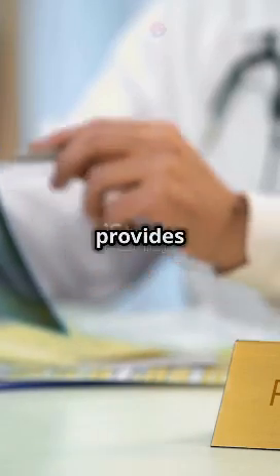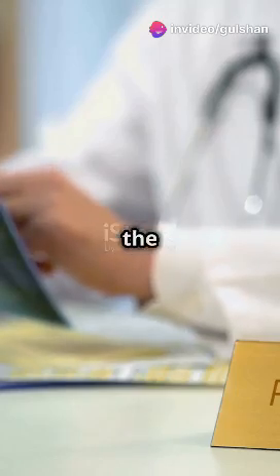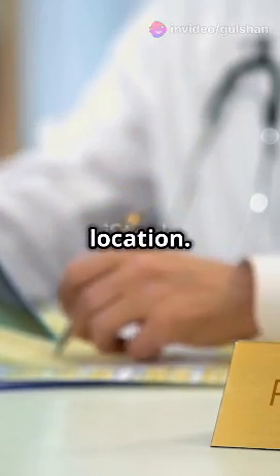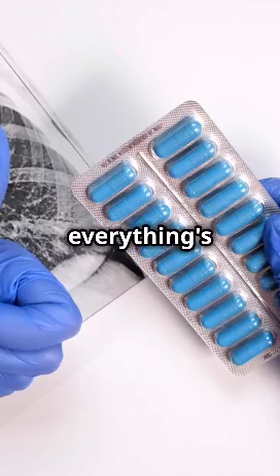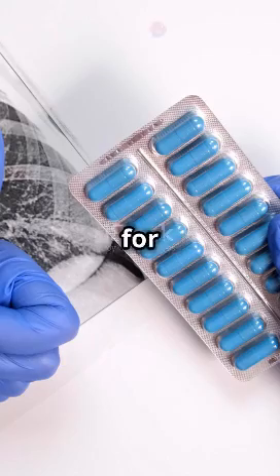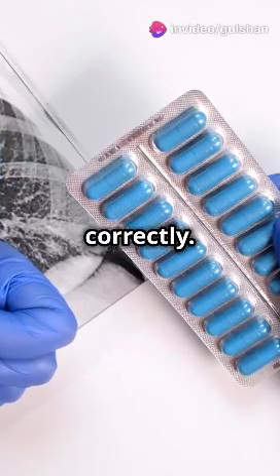The chest X-ray provides a visual confirmation that the tube is correctly positioned in the trachea and not in the esophagus or another incorrect location. Peace of mind that everything's in the right spot. This final confirmation step is crucial for patient safety and ensures that the intubation has been performed correctly.